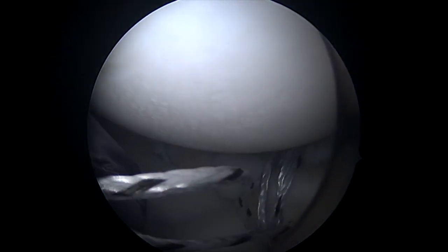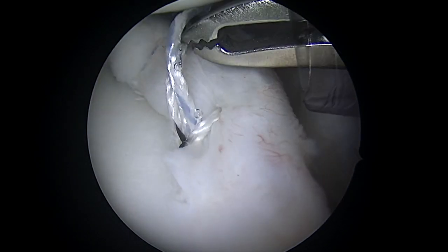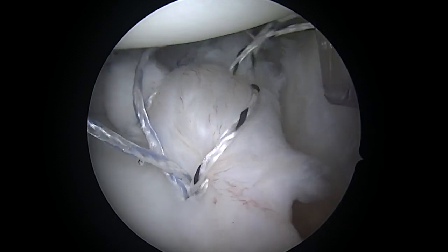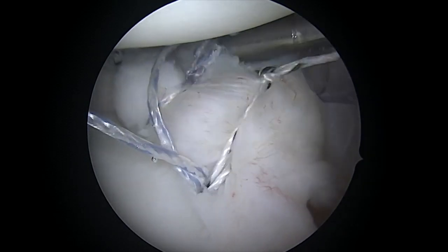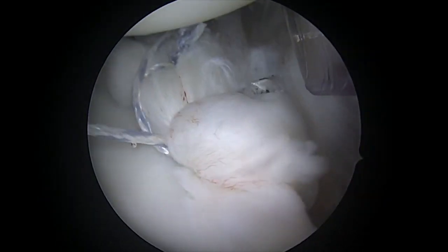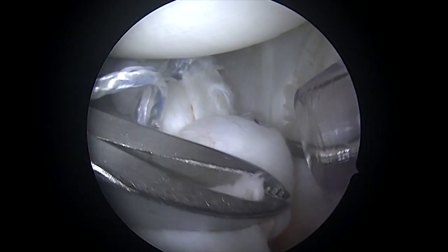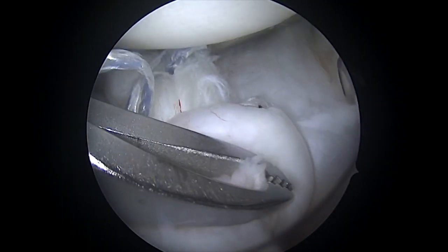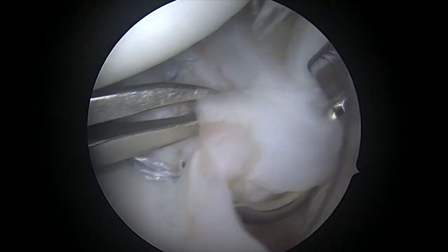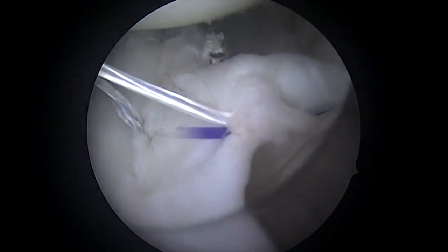Here I'm using that hook to bring the suture all the way through the ligaments. Then you'll see us isolating the sutures and tying them down. As we work carefully here, we're bringing all of that tissue right up to the edge of the socket, and you can also see how that tensions the ligaments and makes it much tighter than when we began. On the last one, you can see me working at the very edge of the tissue to get every last bit we can — coming through in almost a woven pattern, in and out and in again, to weave that suture through and bring as much of the capsule up onto the edge as we can.